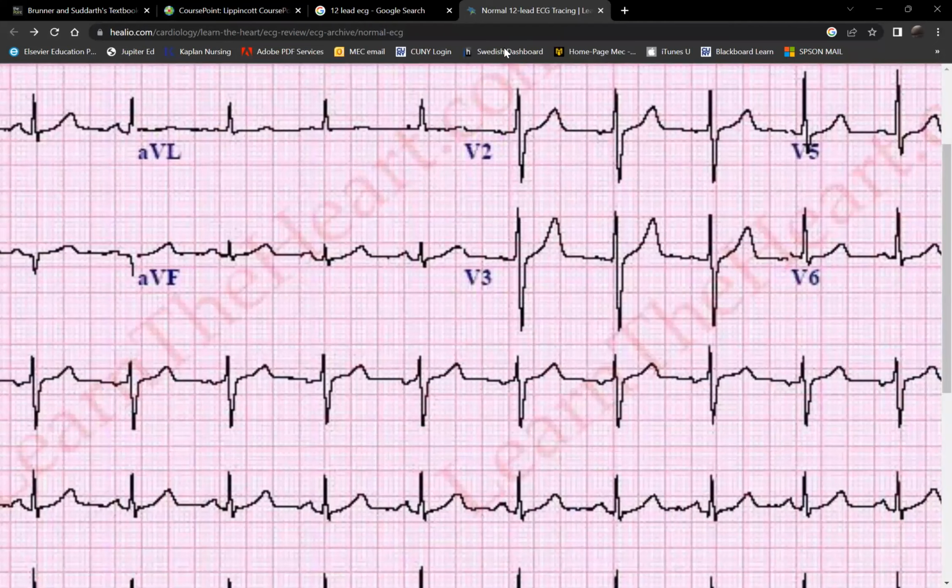However, on a real ECG, they never fall on an exact straight line. So you'll have to make up your own isoelectric line, just estimate it. Okay, like for this, for instance, I can say, oh, this is the isoelectric line. Approximately, this is my isoelectric line.